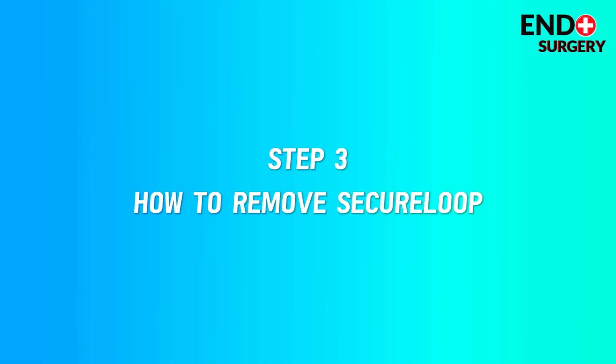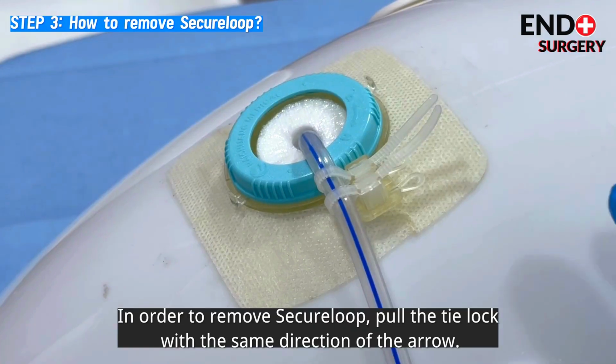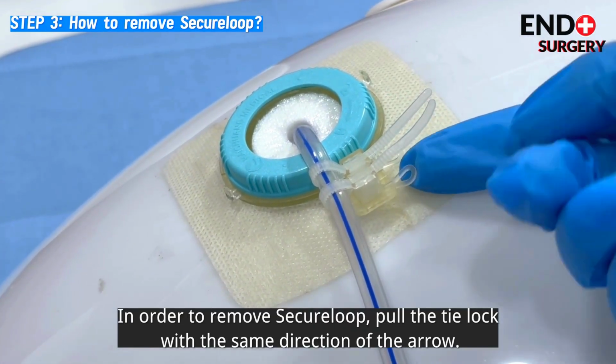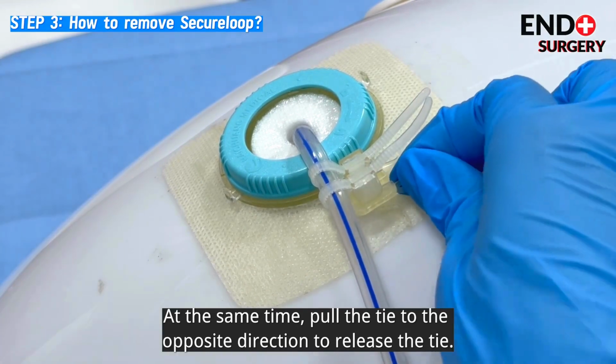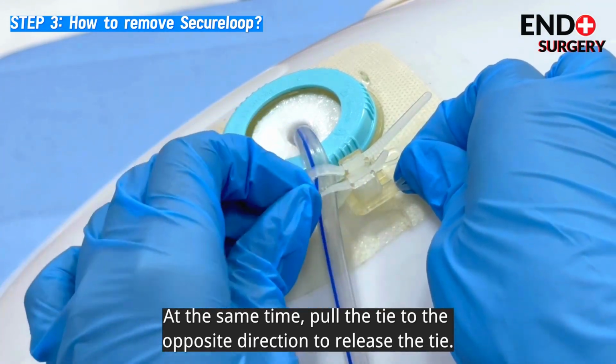Step 3. How to remove SecureLoop. In order to remove SecureLoop, pull the tie lock in the same direction of the arrow. At the same time, pull the tie in the opposite direction to release the tie.